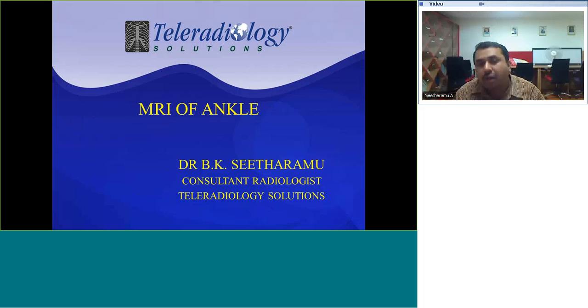Good evening. Today's topic is MRI of the ankle, and today we'll discuss some of the more common things for which MRI of the ankle is referred.